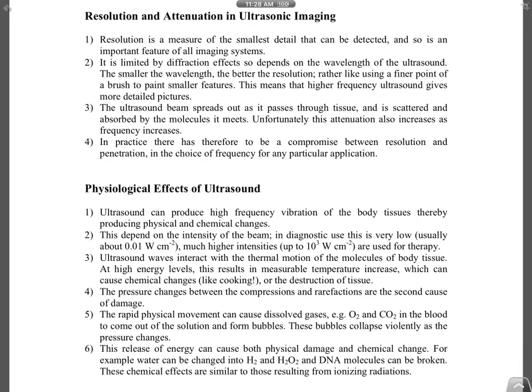You don't have to use a high intensity. If you use high frequency, more is absorbed, so you must increase the intensity, otherwise you cannot reach the end. But with low frequency, less is absorbed, so you can even reduce the intensity. So the amount absorbed by the body is very little. So it will cause very little damage to the cells.